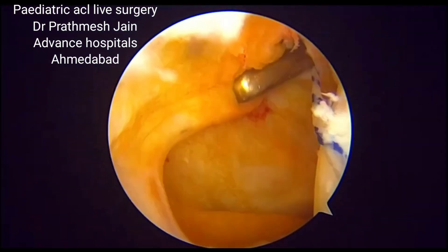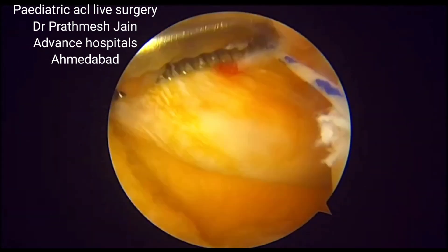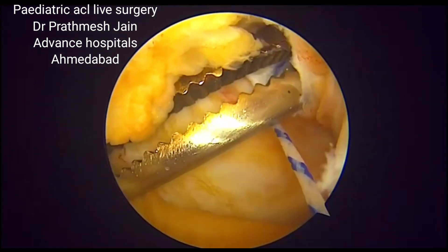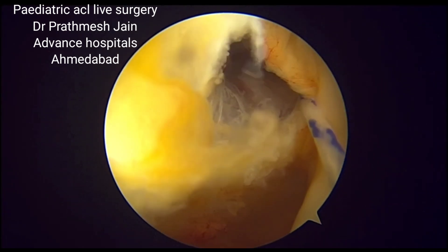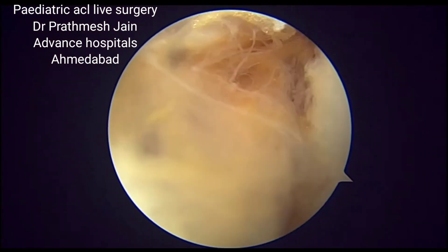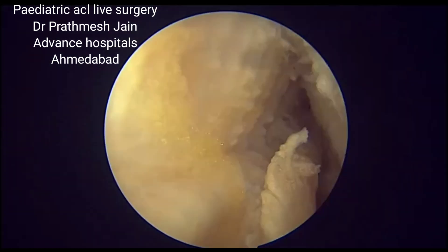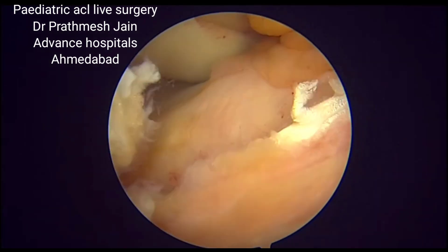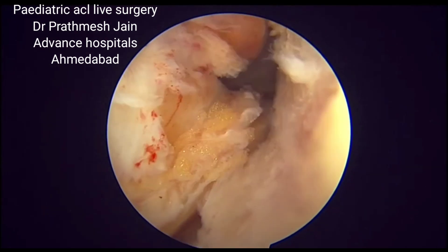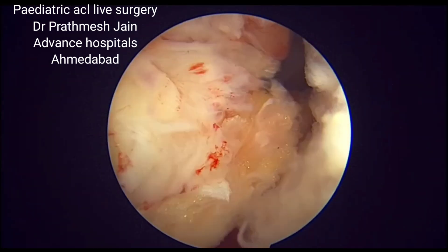This is how we dilate the posterolateral area. Once dilated enough, we pull the wire gently and the fascia lata graft is pulled into the knee joint. You can see the graft is now pulled up into the knee joint, just anterior beneath the intermeniscal ligament, and nicely positioned at its desired location.